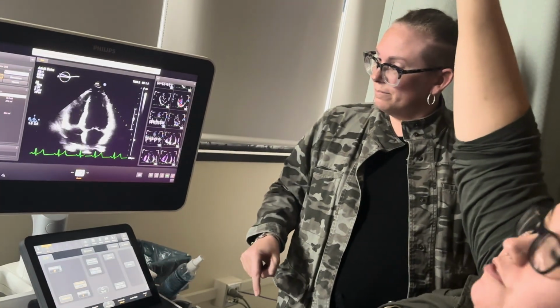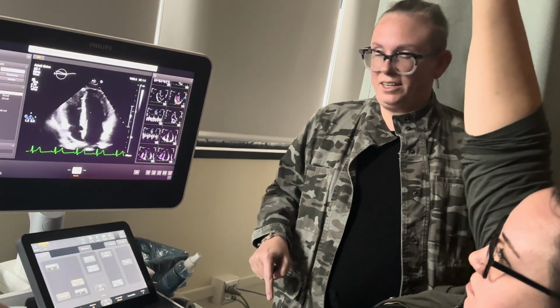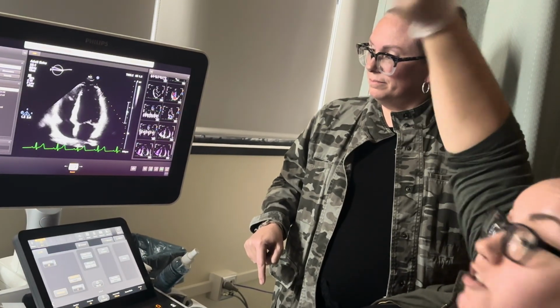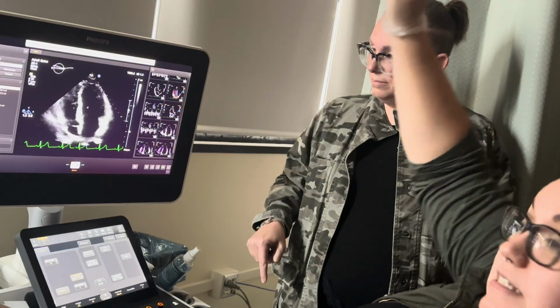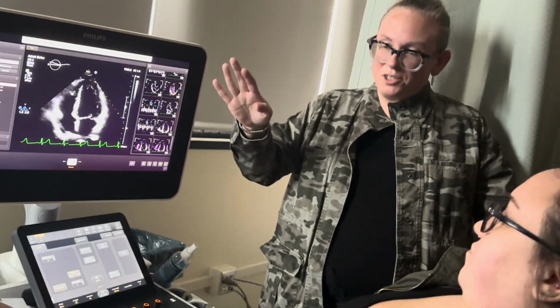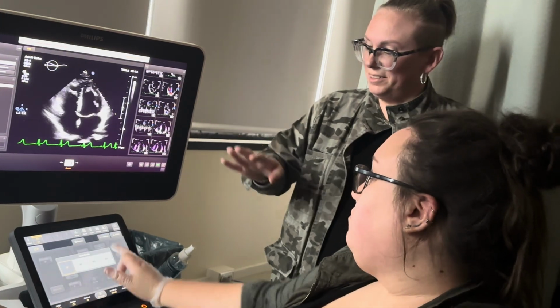I will warn you, you cannot use this on every patient. And you have to be diligent because you could very easily give the doctor the wrong information if you don't recognize that was not an actual 2 chamber. That's why hers was beautiful. That's why we're showing you this, but this is not for you to use yet.